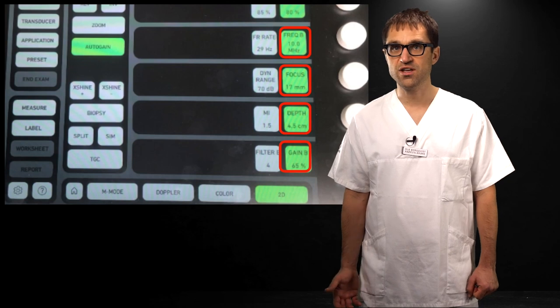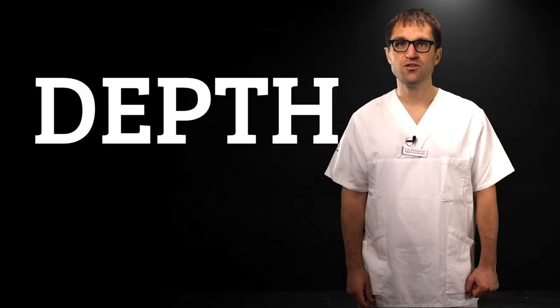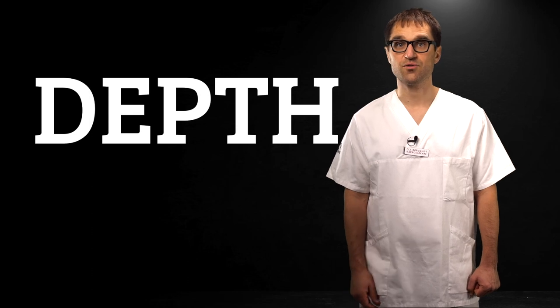Next, familiarize yourself with the ultrasound machine settings. Start by choosing the right preset. There's probably one called Vascular or Venous. For manual tweaking, use depth, gain and focus, and possibly frequency. Depth, well, it does what it says. Use the lowest possible setting that is needed to see the vein, as this gives the best resolution.